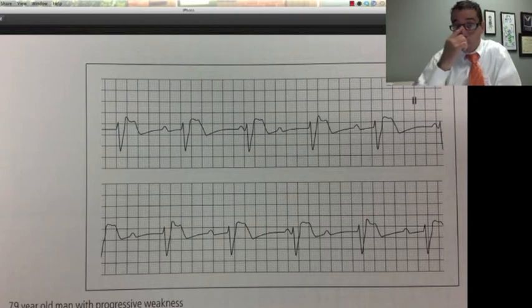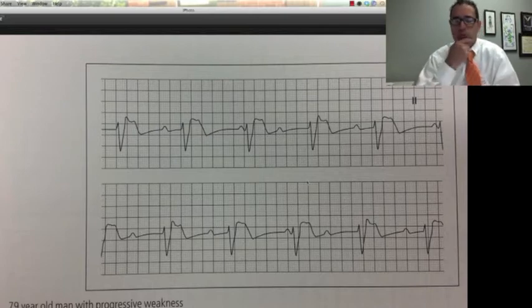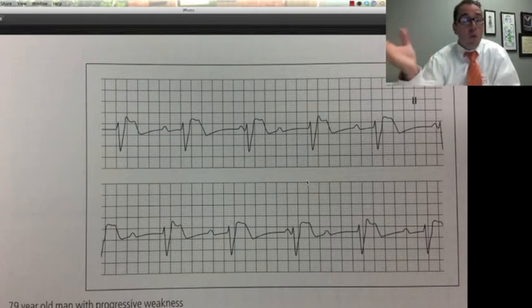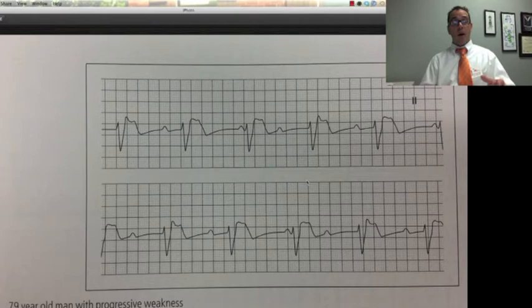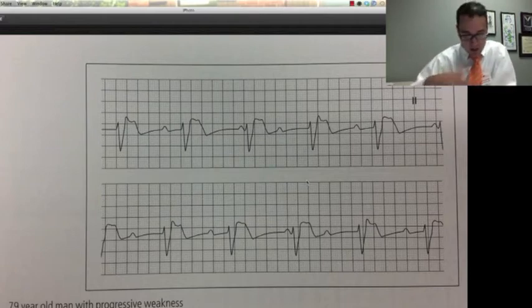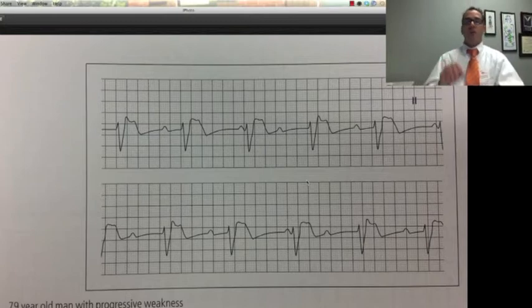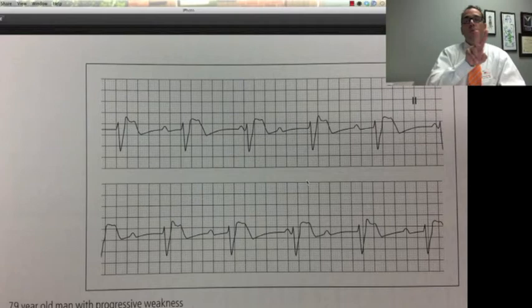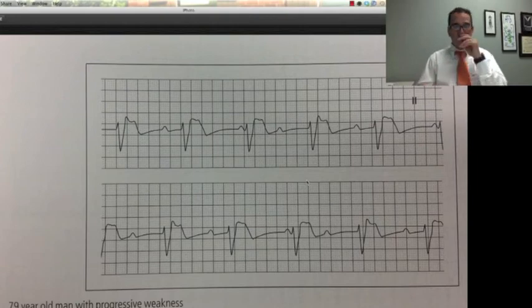This one: 79-year-old man with progressive weakness. You can see a P wave, a long AV block interval, a wide QRS complex. This one falls very close, and this one doesn't match. Either this is a Wenckebach getting longer, or a complete AV block where they have nothing to do with each other, or a second degree type 2 where it's just a P wave getting dropped. If we take our calipers to measure intervals, we can map out every P to each other and every QRS to each other, but when you map them between the two, they don't match.